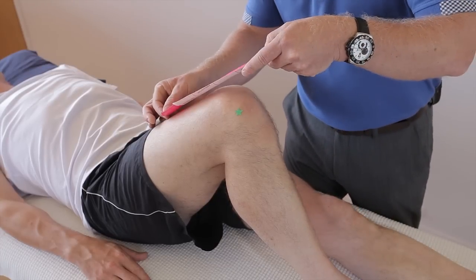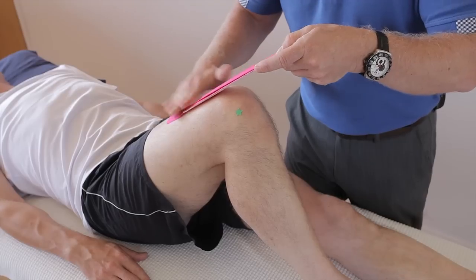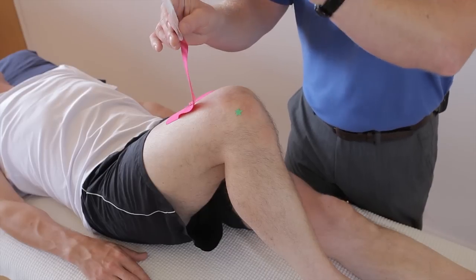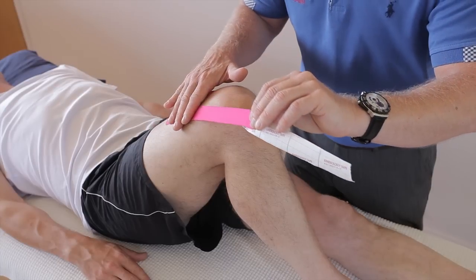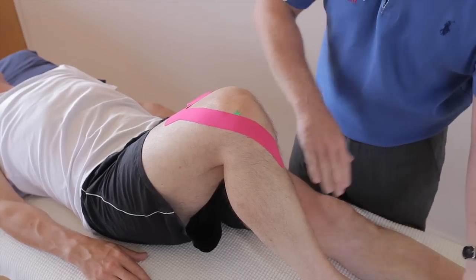This is the quadricep expansion, where the quadriceps come down. Stick that first part down, then pull and peel back to the first square. Little to no stretch — it's very tempting to stretch this tape, but apply it with little to no stretch. Just apply that around the lateral side so it crosses the tibial tuberosity.